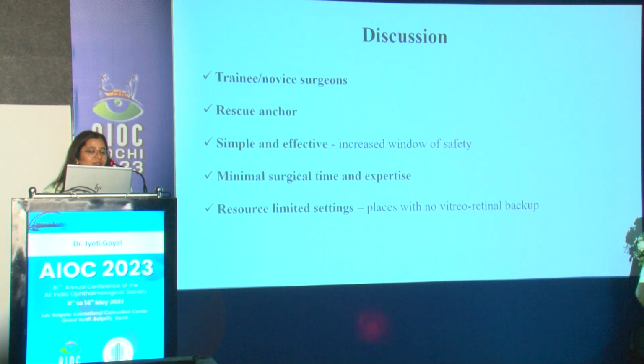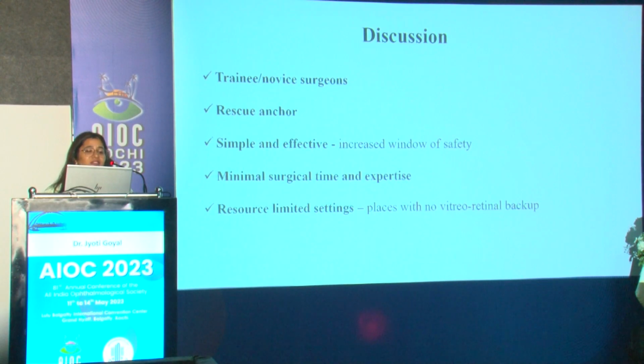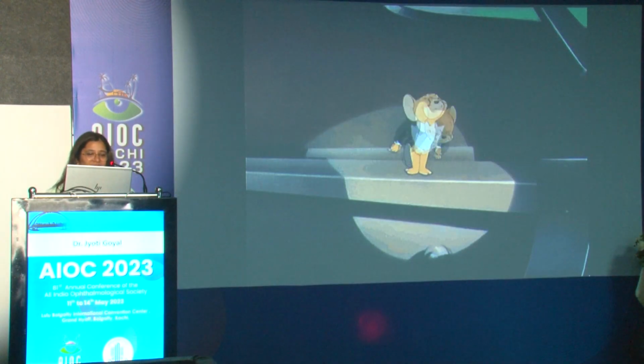This sling acts as a rescue anchor, and it is a very simple and effective technique which increases the window of safety for all novice surgeons. It requires very minimal surgical time and expertise, and this is very useful especially in resource limited settings, places where there is no vitreoretinal backup. This technique can be a saving technique. Thank you.